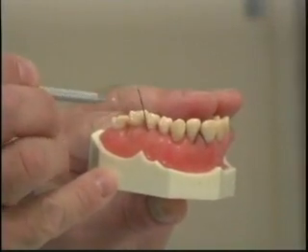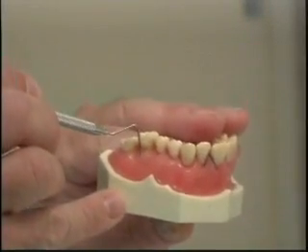So we go from that side of the model to this side of the model where everybody's happy, feels fine, there's no pain, no problem, but now the probe goes in deeper, and that tells me there's been some bone damage. So this would be 5, 4, 5, 5, 5, 6, 6, 7, 8. If the probe goes in that far under the gum, the only way that could happen is if there's been some bone loss.